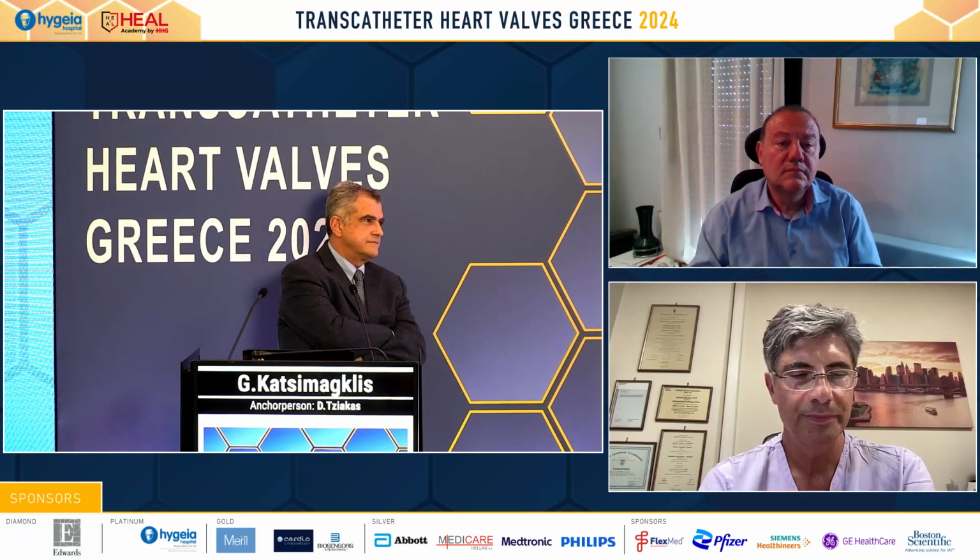Well, did you have such a case, or if yes, how did you deal with it? The main cause for balloon expanding valve embolization is the loss of capture. Loss of capture. And the main cause of balloon expanding valve embolization inside the left ventricle is the bad measurement during the CT angiograph. Yeah, there are too many mechanisms for that, but we will talk.